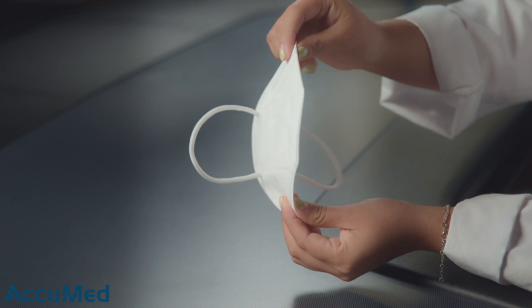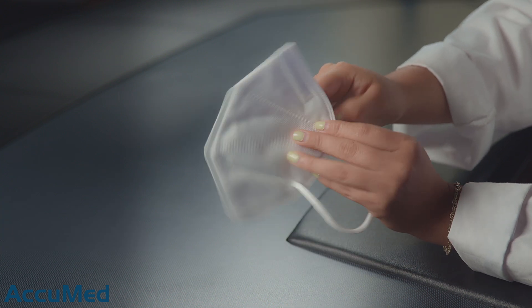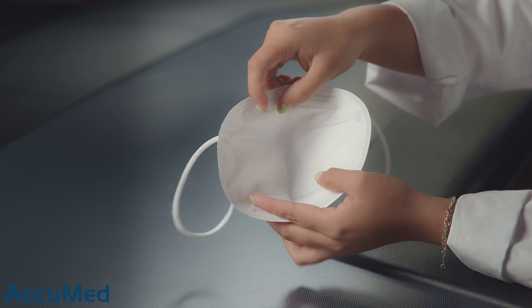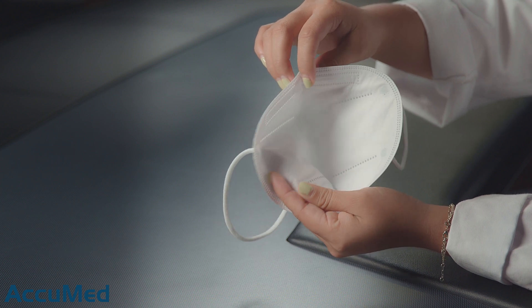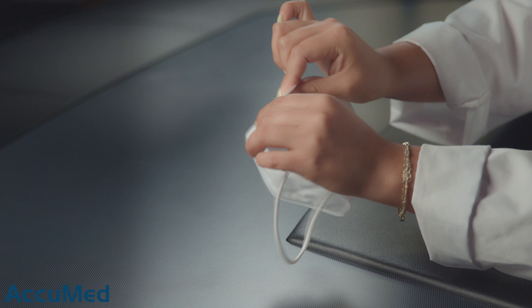Let's take a look at this mask before we test it with our TSI machine. This is a K95 bifold style and they don't have any markings on them. They also state on their listing that they are a five-layer mask with three of those layers being melt-blown. This is how they look from the inside — they are a very soft material.